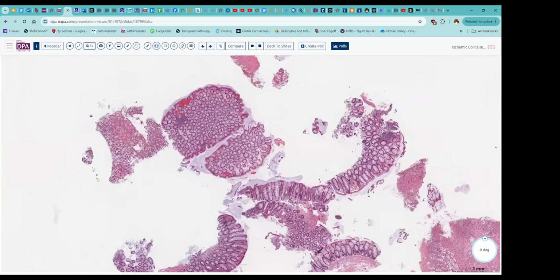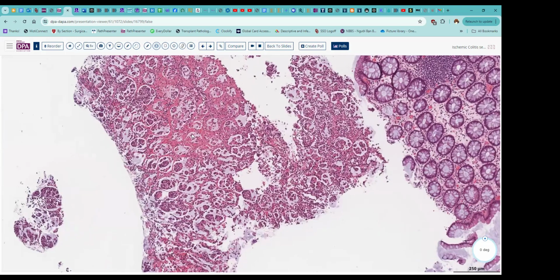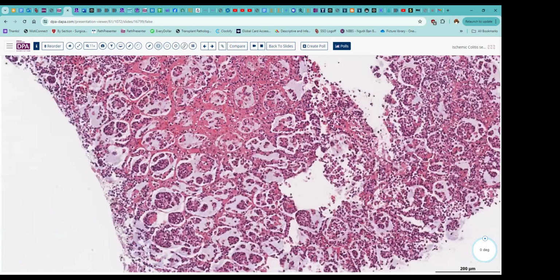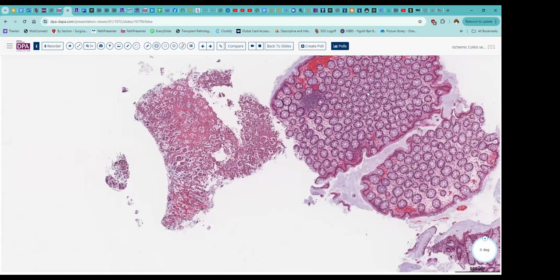So let's go and look at this area first. This is the pattern of pseudomembranous type colitis or withering glands, where the glands are all distorted and destroyed, and they hypersecrete a mucin to sort of wash out the toxin or whatever that's annoying them. You get fibrinoid necrosis to the cells and so forth. And it's kind of geographical.